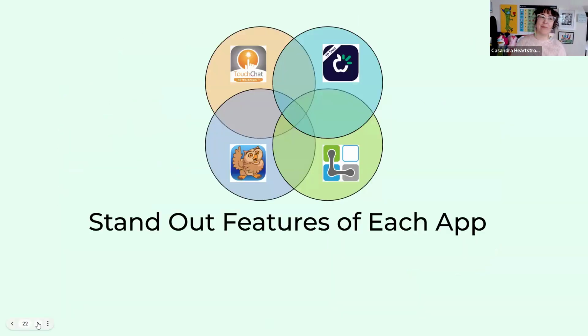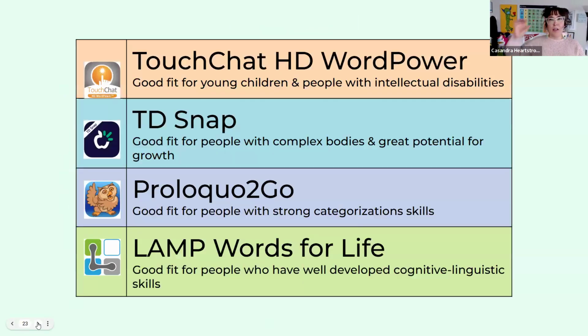So now we're going to just look at some standout features of each app. I have just a very general, what population is good for each app? What does the app really do very well?